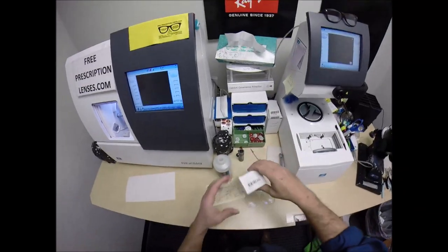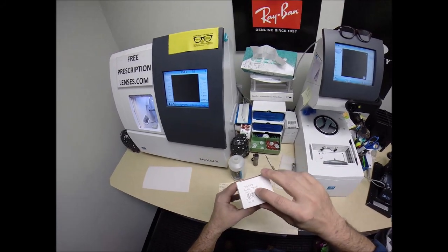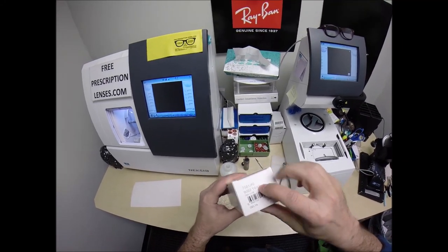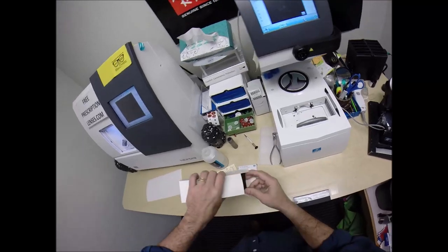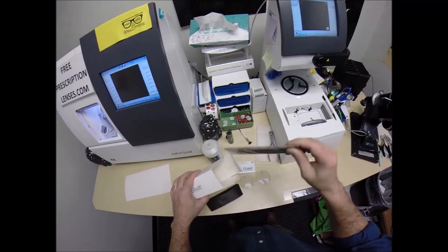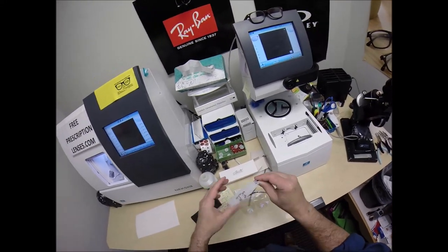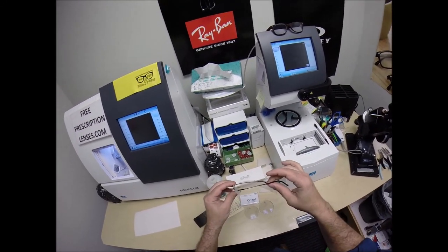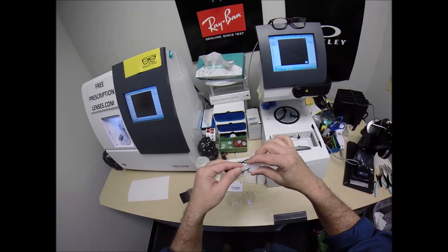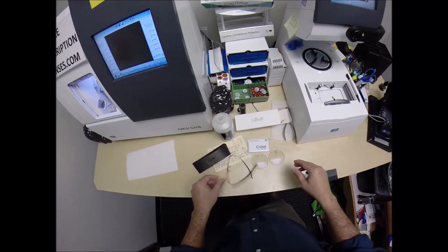Let me take everything out of the original packaging as Silhouette sends it to me. This is series, also known as chassis, 7581. The color is 6062, which is the Bordeaux wine — a reddish color — with a 19 bridge and 145 temple length. It comes with a little Silhouette cleaning cloth, a plastic sleeve on the frame, and the temples and bridge mounted separately. There's also a plastic sleeve on the temple to protect it from rubbing during shipping.